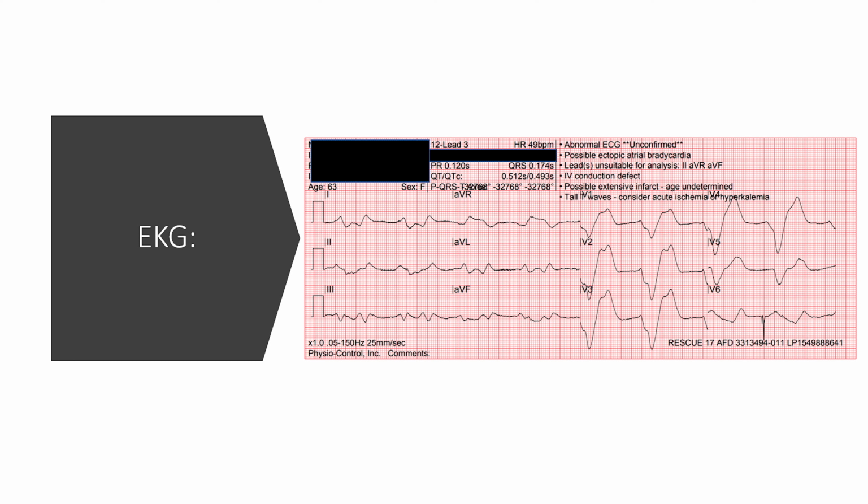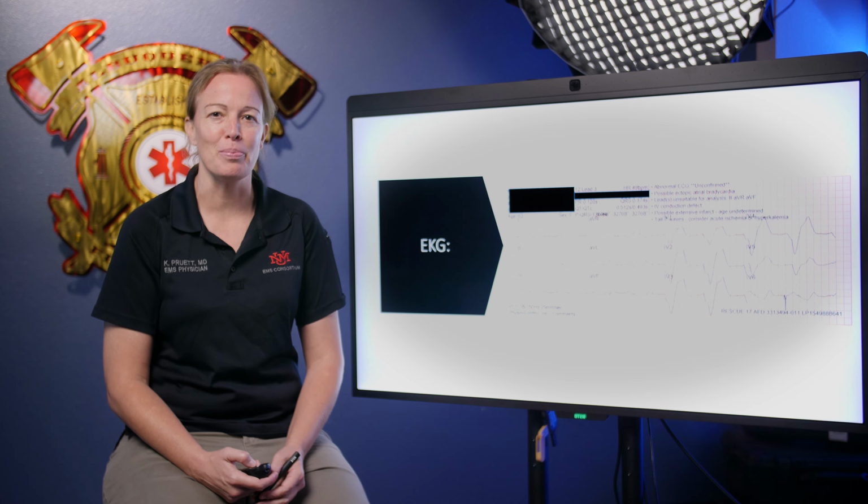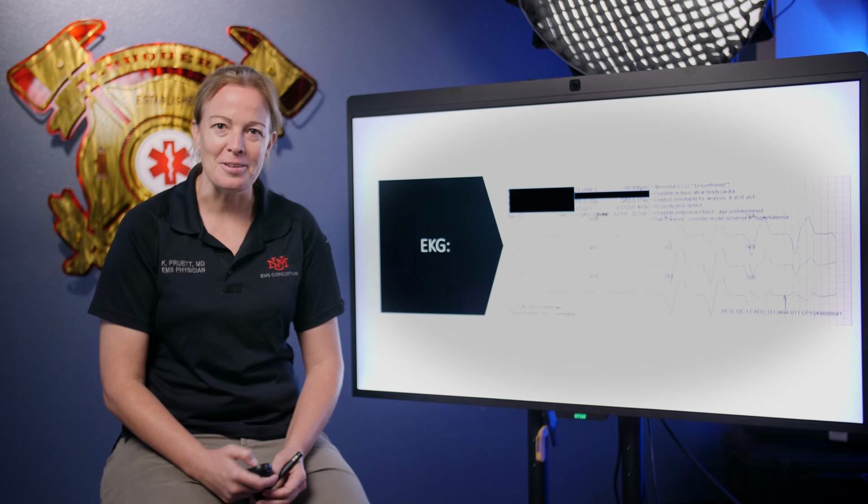I'll give you a second to take a look at this one. I don't know about you, but my first impression when I saw this one was, oh my goodness, this patient looks sick, right? Without even knowing what was going on, I had an instant suspicion. So I hope, just like me, by the end of this session, you've burned this one into your head and you recognize it instantly and know what you need to do.